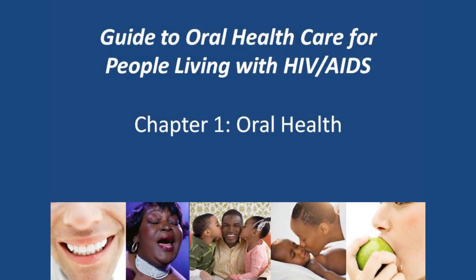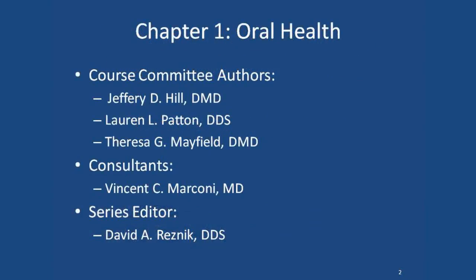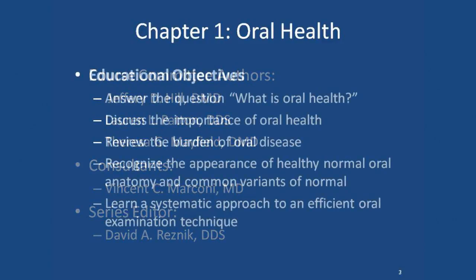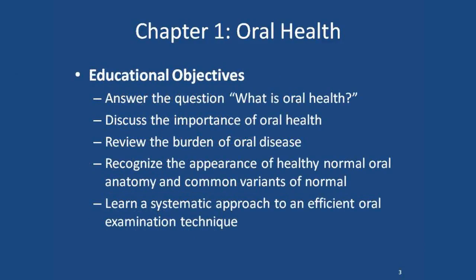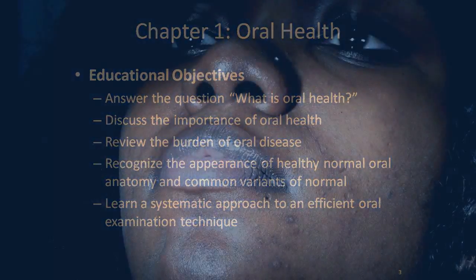Today we're going to be demonstrating how to do an intraoral exam for your patients. We want to first make sure we have everything we need, which would be gloves and a light source — either a light on the wall in the exam room or a pen light. You'll also need something to use as a tongue depressor, either an actual tongue depressor or a disposable intraoral mirror.